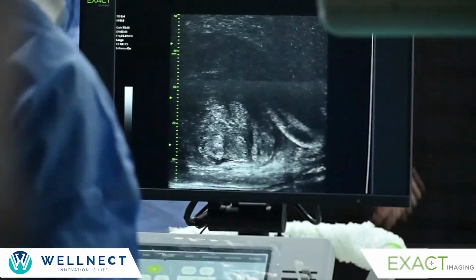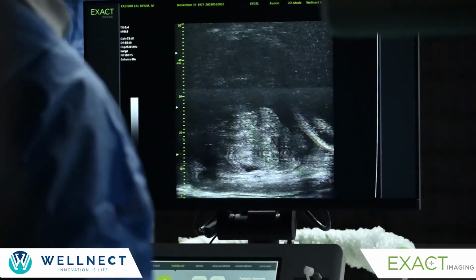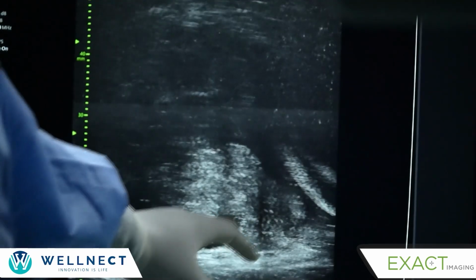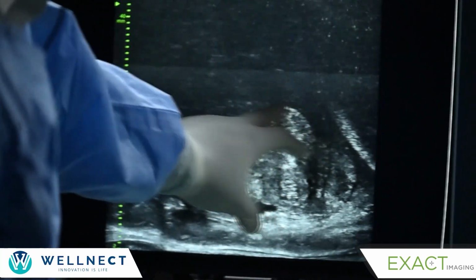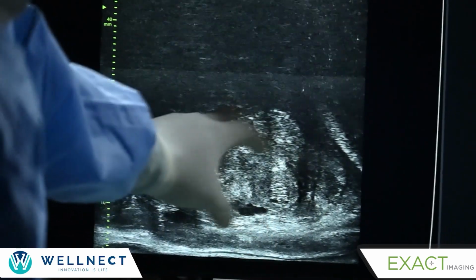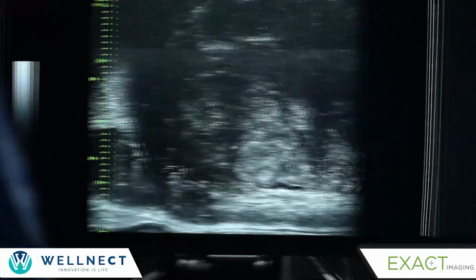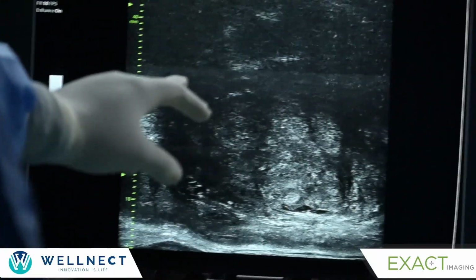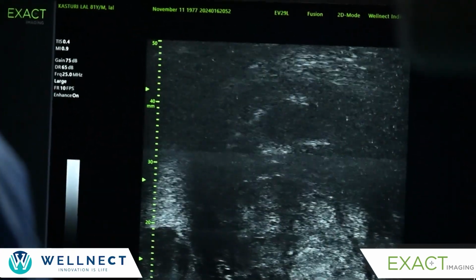Now the first thing that I would look for is the urethra. Can you see this catheter? Yes, sir. So instead of the urethra, this is the catheter which you see. Now the cauliflower that you see, can you appreciate this region as a cauliflower? Yes, sir, we can clearly see. So you can see the rest of the prostate, and you can definitely see this lesion. So this is the typical cauliflower lesion, and that is how you understand.